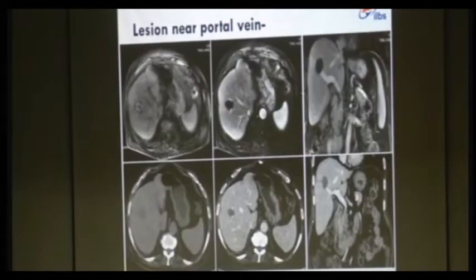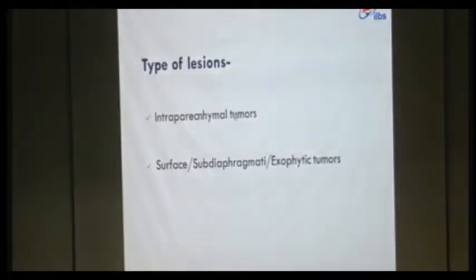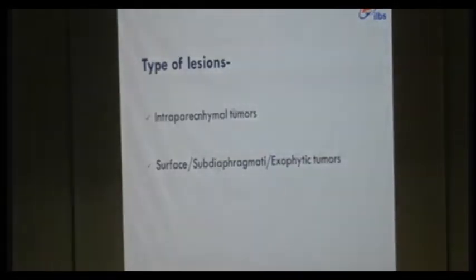At 1 month follow up image we see T1 hyperintensity because of hemorrhage, with no obvious enhancement on venous phase, and these portal radicals are preserved. Coronal section also finds no obvious enhancement, suggestive of complete necrosis. This is the 1 year follow up, showing significant decrease in size of the ablation zone and no obvious recurrence, suggestive of complete response.